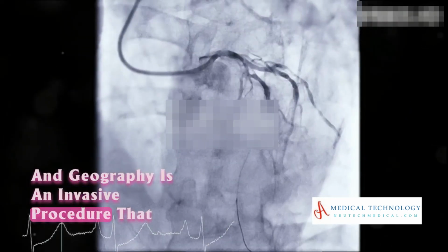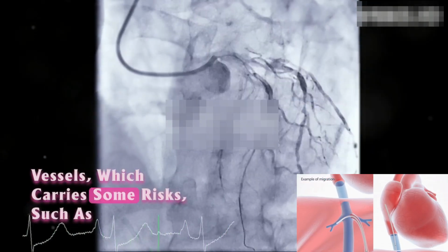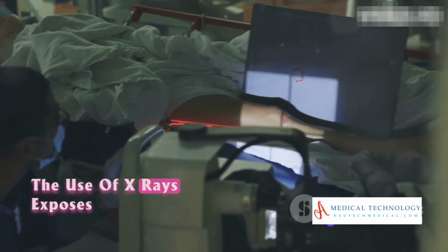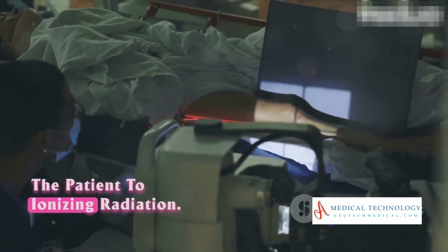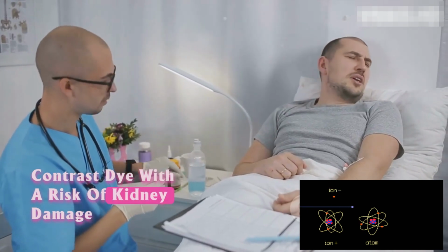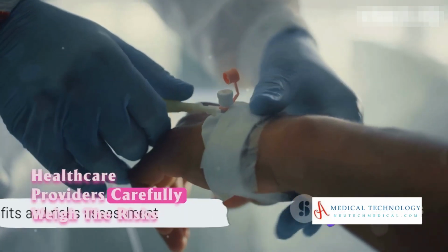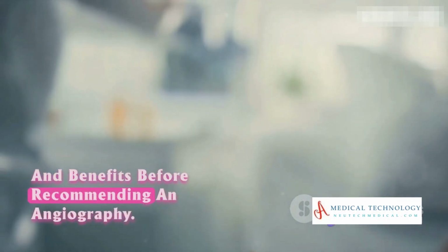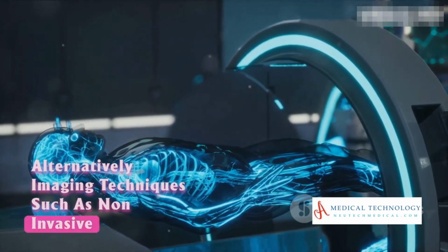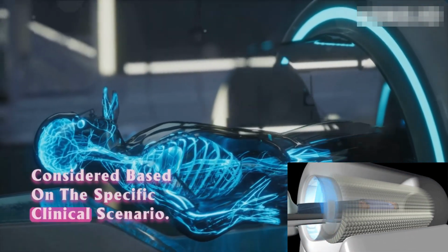Angiography is an invasive procedure that involves inserting a catheter into the blood vessels, which carries some risks, such as bleeding or infection at the insertion site. The use of X-rays exposes the patient to ionizing radiation, and some individuals may be allergic to the contrast dye, with a risk of kidney damage in patients with pre-existing kidney conditions. Healthcare providers carefully weigh the risks and benefits before recommending an angiography. Alternative imaging techniques, such as non-invasive CT or MRI angiography, may be considered based on the specific clinical scenario.